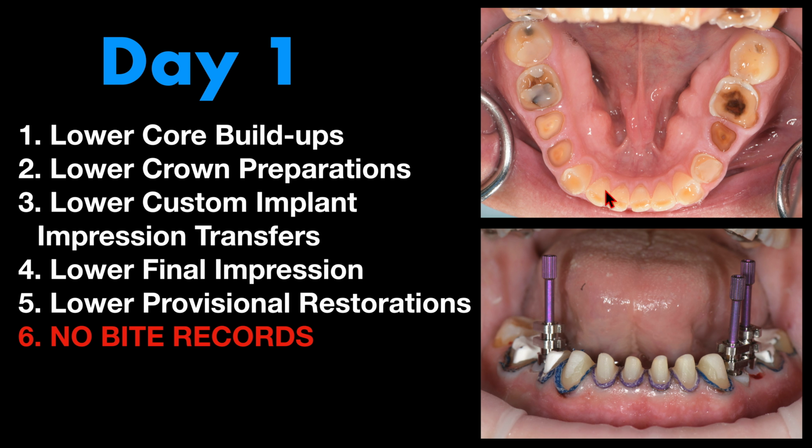So part of this case, we were debating also, do we use crowns on the lower incisors? And I was torn. The enamel was very thin on the facial of these teeth, and the incisal edge was worn down. So I felt in the end, I was going to go to crowns. The cuspids, there was no question that it was going to be crowns because the whole facial wall was eroded. The incisors had a little bit of enamel left, but I was concerned that it wasn't going to be a quality bond for my veneers. So we just went the more predictable route and did this case with crowns.